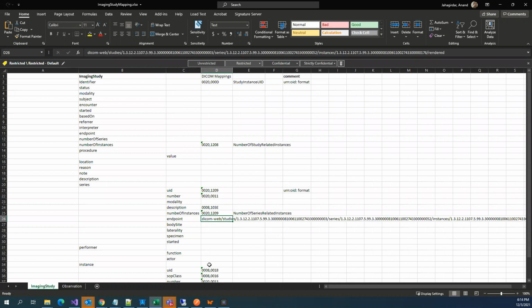I am not sure of Philips, but I heard the modern PACS, some of them have this HTML viewer, and they do support these DICOMweb interfaces, but I'm not too sure which commercial ones already have all this flexibility. We also have a solution, but as I said, it's an outside thing. It is not well integrated yet.